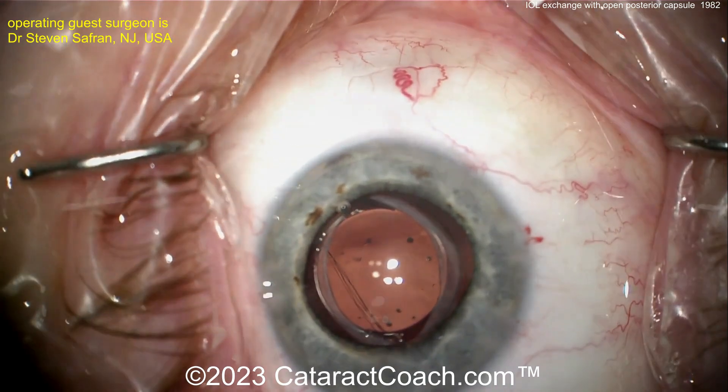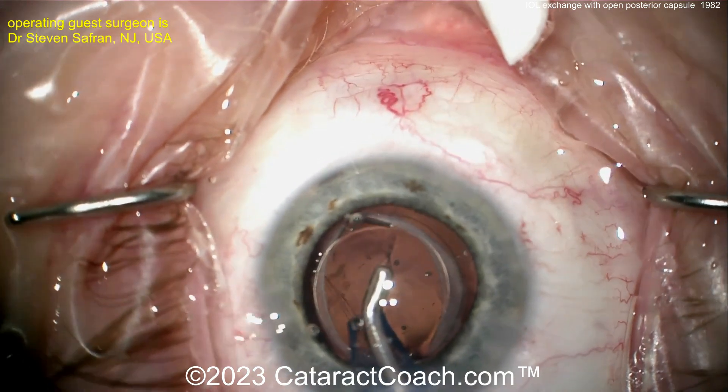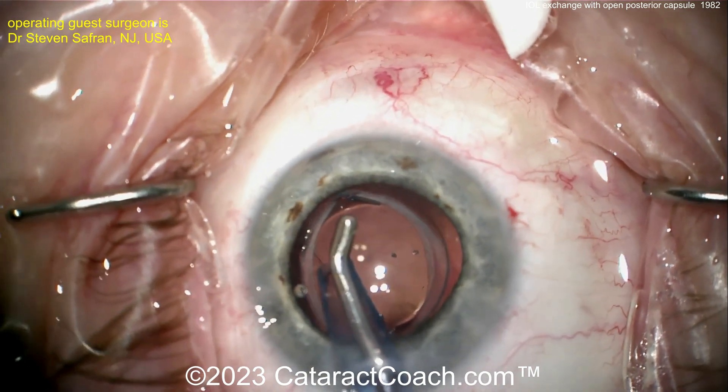This technique comes from Jack Holliday — there's an upcoming podcast with him where he explains everything about negative and positive dysphotopsias and how best to deal with them. He recommends this reverse optic capture, with haptics behind the rhexis and the optic in front of the anterior lens capsule. This should help tremendously with the dysphotopsias, especially with a silicone lens.